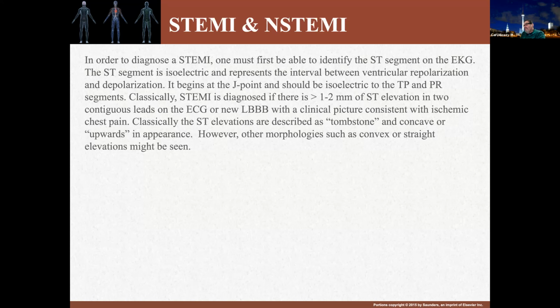or sometimes upwards in appearance. Tombstones was the common phrase, and it was actually in a way a kind of dark humor, because an individual with a really significant ST elevation, tombstone, in fact, was going to end up with that.